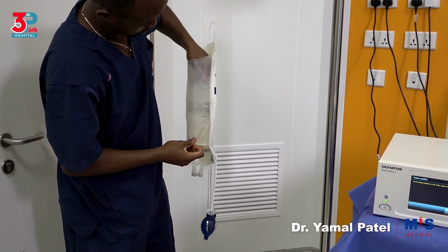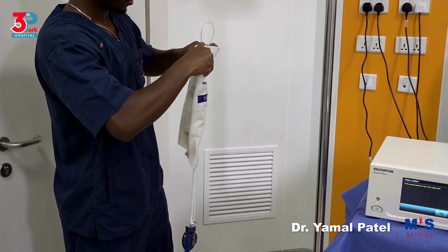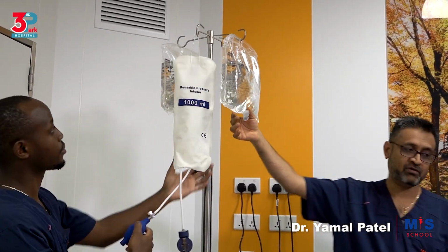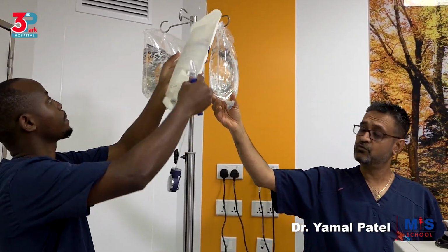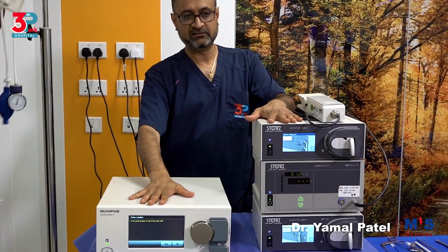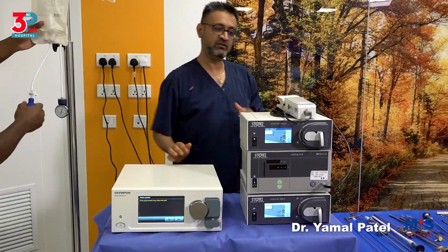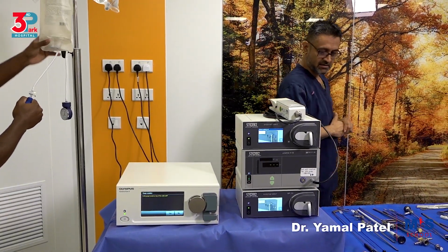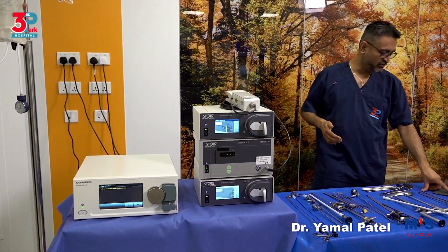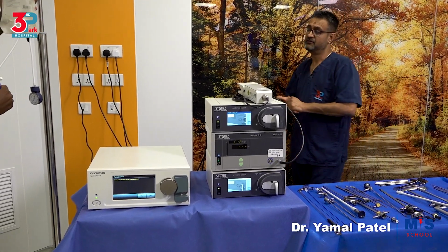And therefore, you can get a better distension of the uterine cavity. And then the third one is where you have this fluid connected through pumps like these. These are called hysteroscopy pumps, or the fluid management system. And the hysteroscopy pumps are actually the most accurate way of delivering the fluid.